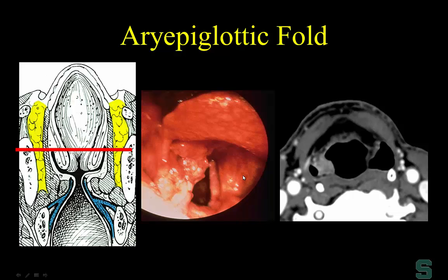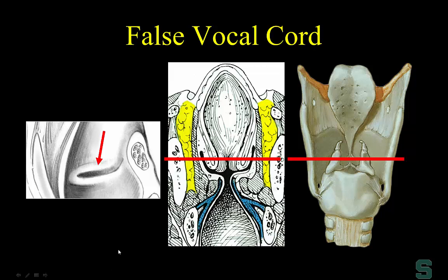On CT, there's the epiglottis anteriorly — midline. Here's the normal aryepiglottic fold on the left. On the contralateral side, the aryepiglottic fold contains a mass — the carcinoma. Notice what it does to the piriform sinus: it's actually pinching it off. This is important for vocal cord palsies — in vocal cord palsy, the ipsilateral piriform sinus will be dilated. The false vocal cord is conceptually the toughest structure for me.